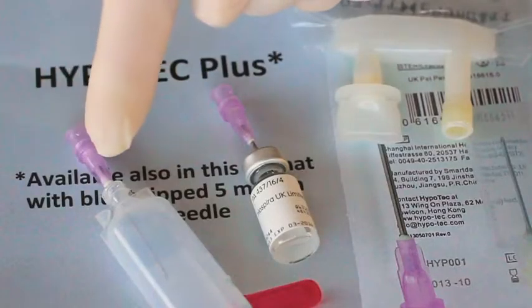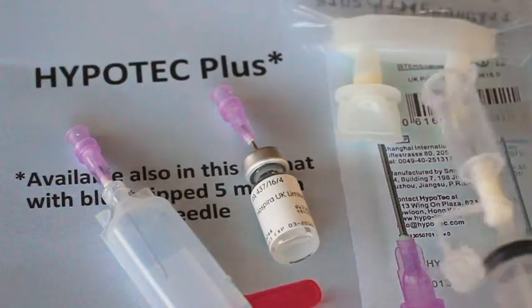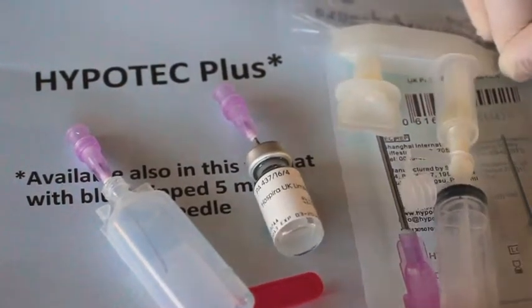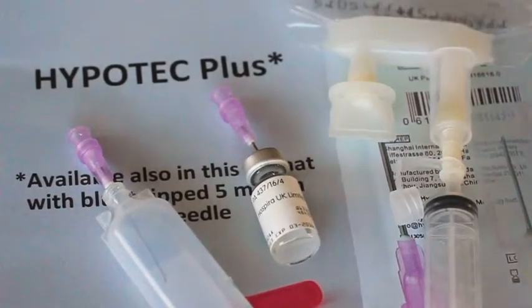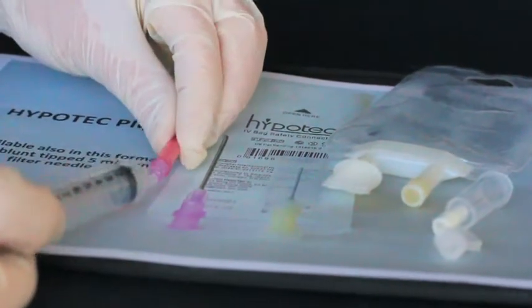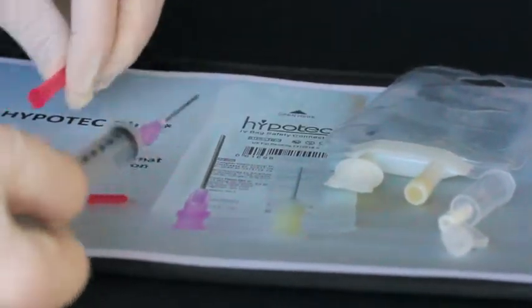By using the filtered needle to draw up medication from plastic and glass ampoules and rubber top vials, one can maintain best practice. The filtered drawing up needle guard is best removed without twisting.